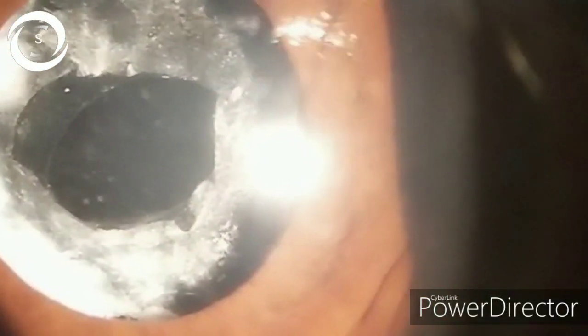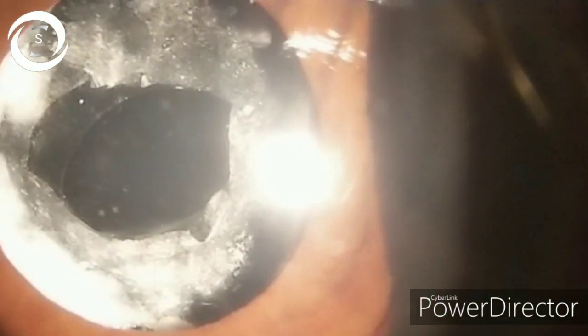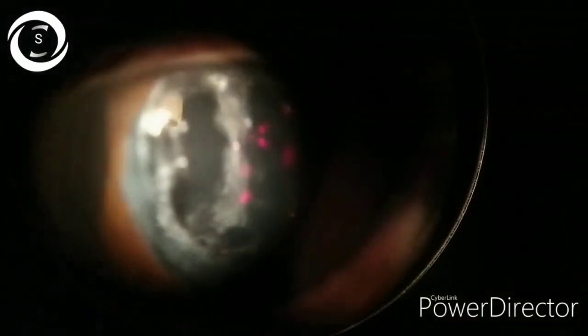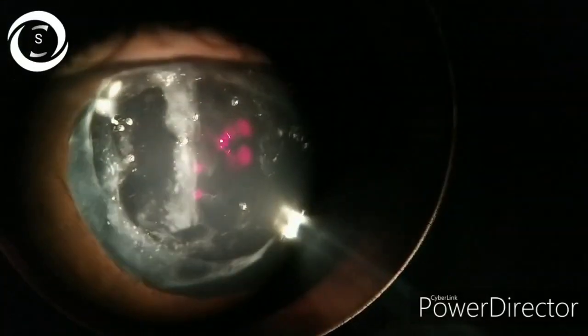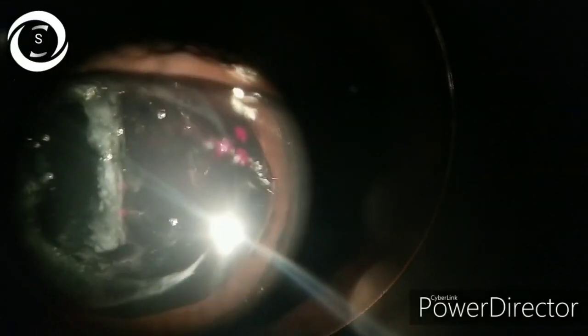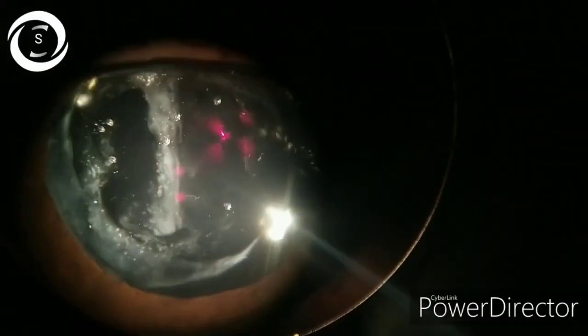In adults during cataract surgery, thorough cortical fibers cleanup with irrigation-aspiration cannula and manual polishing of the posterior capsule to remove all epithelial lens fibers is the best method to decrease its incidence.